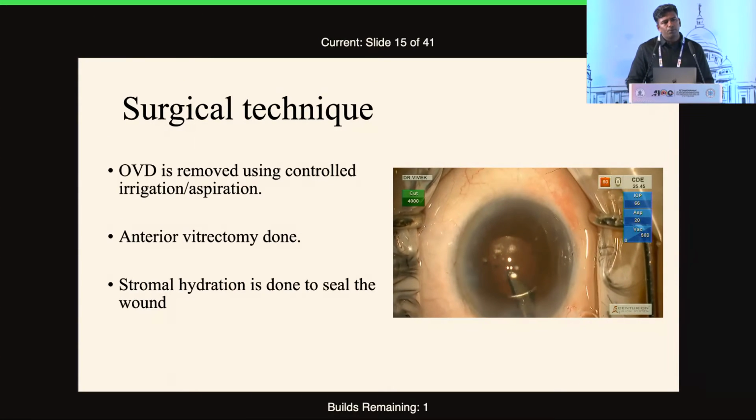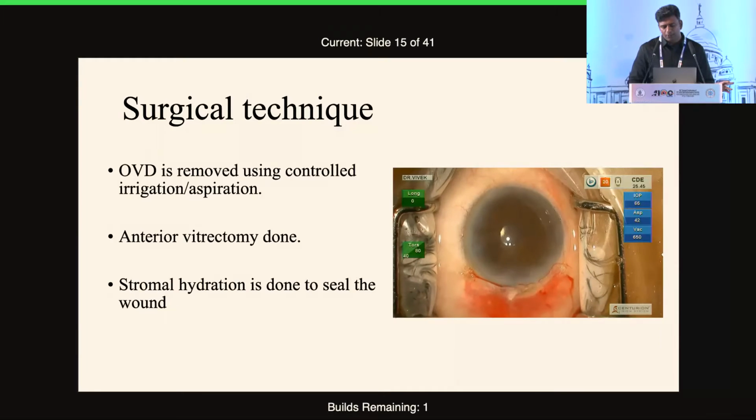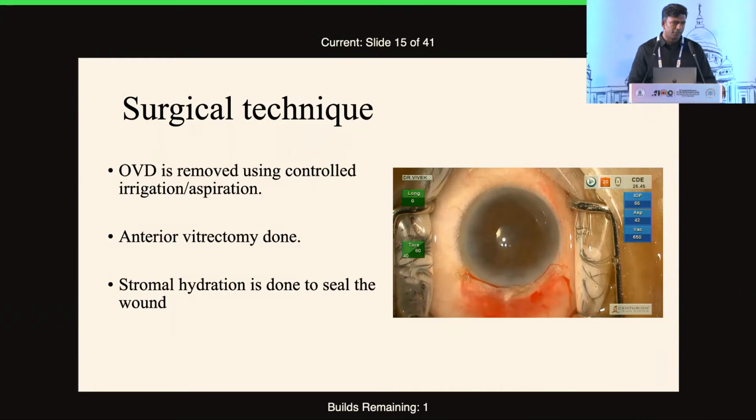The other important point is to always do your vitrectomy prior to placing the intraocular lens or taking the suture bite. These sutures are so thin. If you have a small vitreous strand at the end of surgery and try to do a vitrectomy, there are chances that you cut the suture and you have to repeat the entire procedure. So make sure you do a proper thorough anterior vitrectomy and then you go in for the iris fixation.